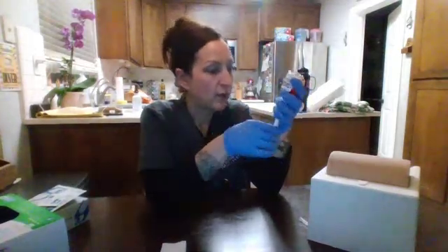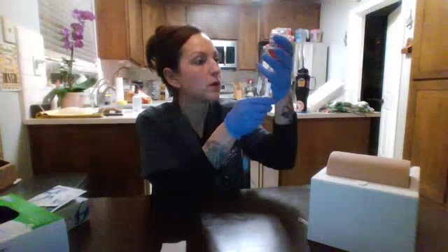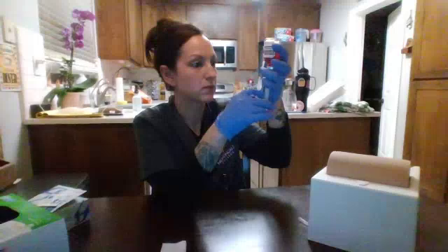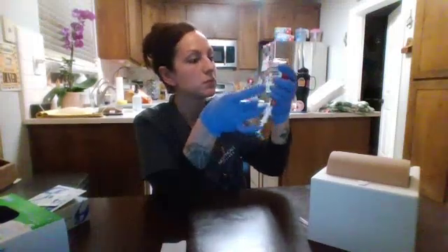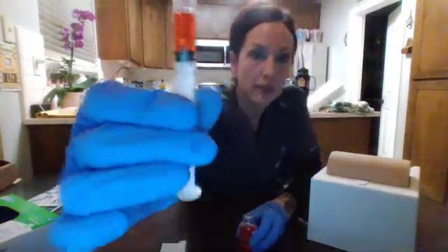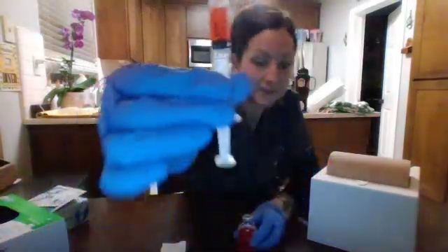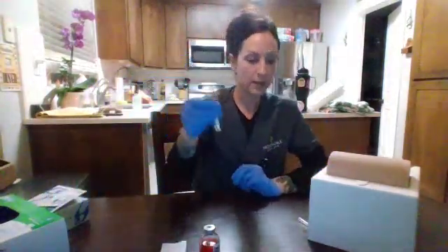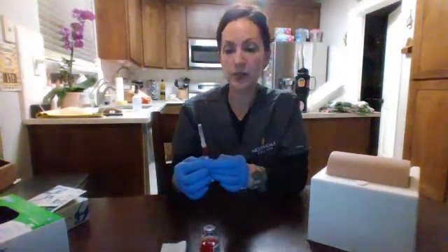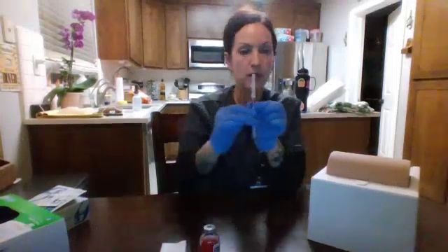Let's go ahead and flick out the bubbles. Okay. I have 1 ml of medication. I'm going to use the single scoop method to recap my needle. If I was to be drawing up this medication away from patient's bedside, I would label this syringe with the patient's name and the dose. I'm going to set this aside.